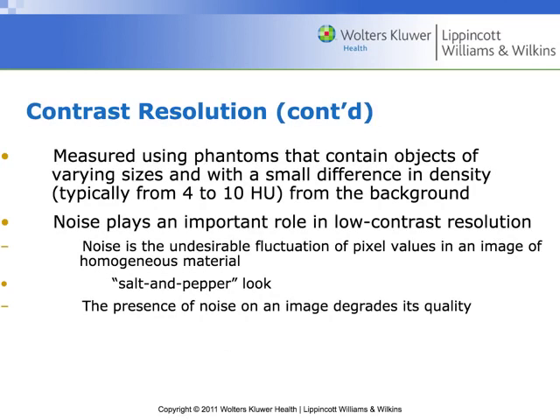Because of the way the reconstruction algorithms work, when it's sampling a volume of interest from the CT scanner point of view, it samples it as a continuous function, sampling continuously as it spins, right? If there's some kind of noise, if the patient has keys in their pocket, it is going to keep that noise throughout the entire sample.